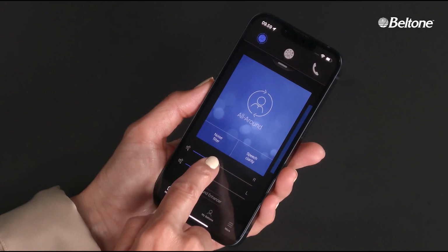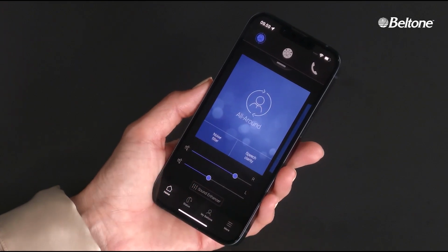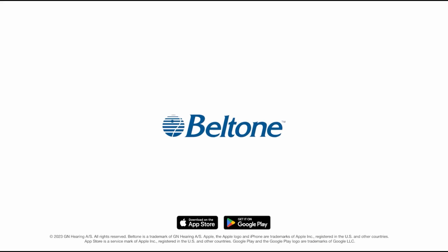of the screen. The image on the screen goes back to the all-around page and the finger holds down the blue dot for the R right side and moves it slightly to the right, as the display counts upwards from 5 to 6 to 7 to 8 to 9.